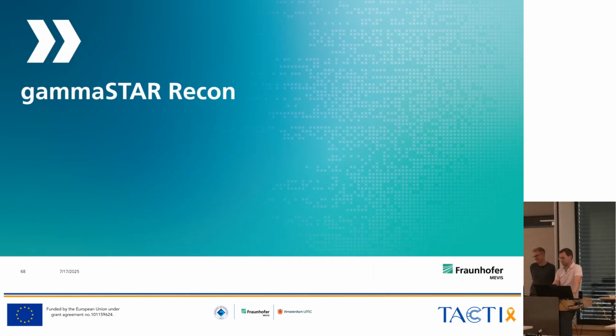The reconstruction server, based on the sequence information, would read out what's needed to get a correct representation of this image, which is not always the same.